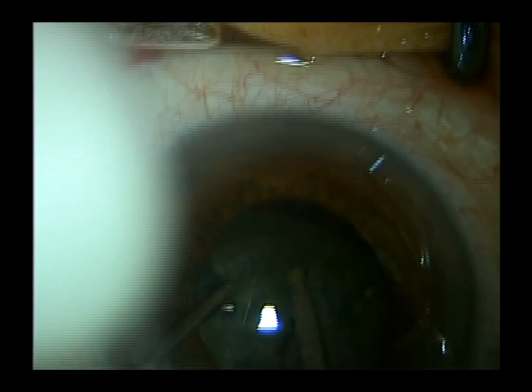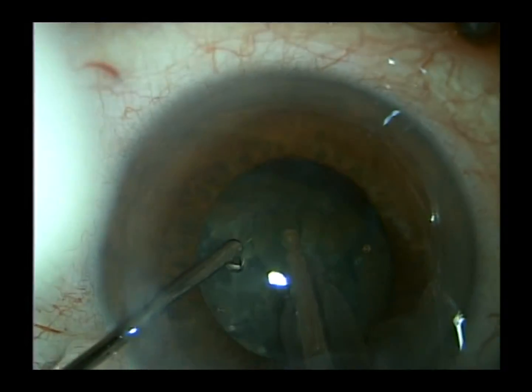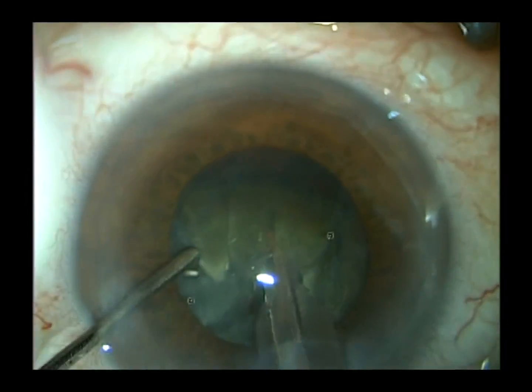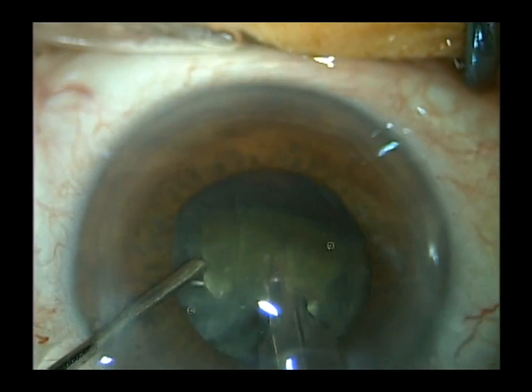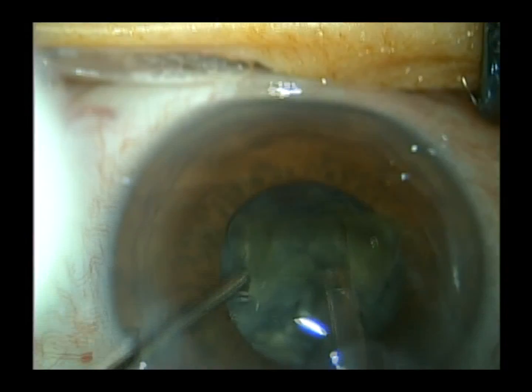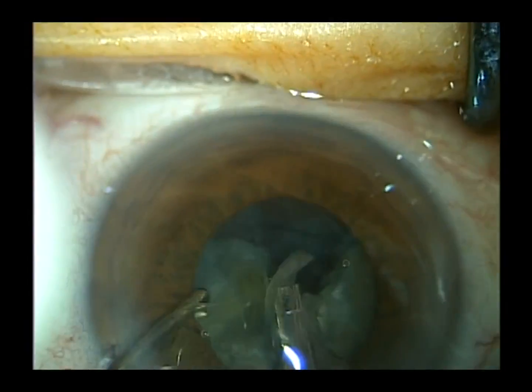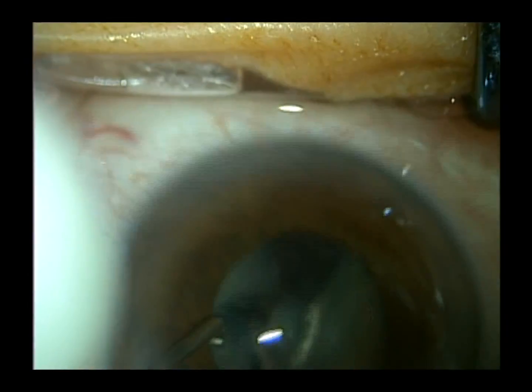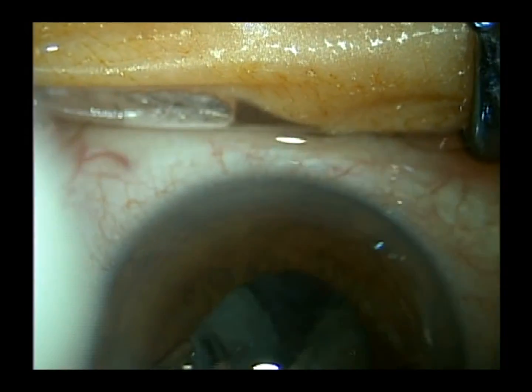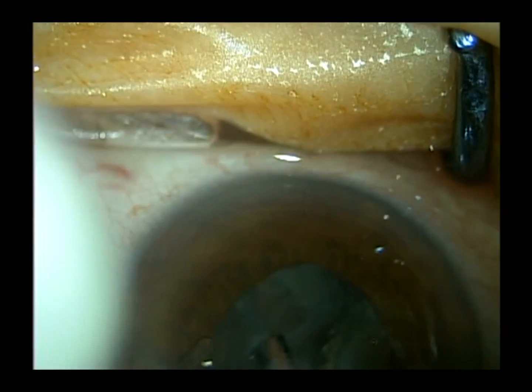quadrants that I've created by increasing my vacuum on the phaco, lollipopping one quadrant up into the anterior chamber, and then emulsifying it. We use the Ellipse FX phaco handpiece, which is very efficient at safely removing very dense cataracts such as this one. Then I've already taken out one quadrant, so I'm going to go for the second quadrant.